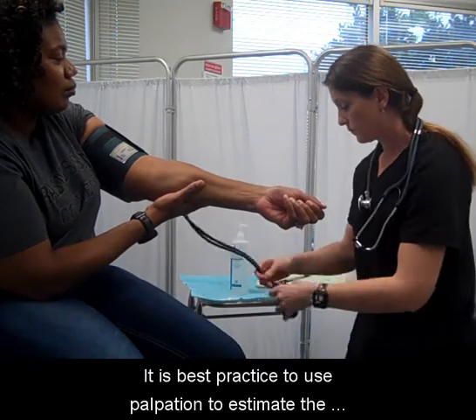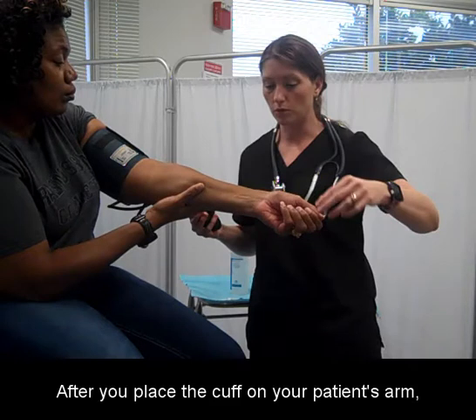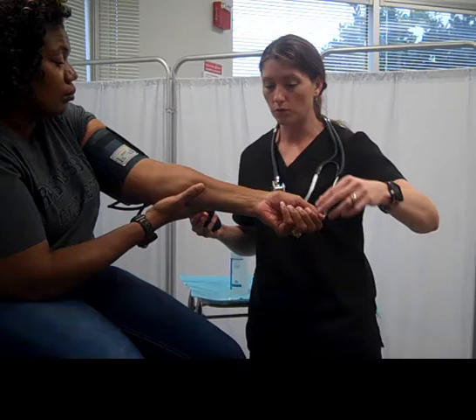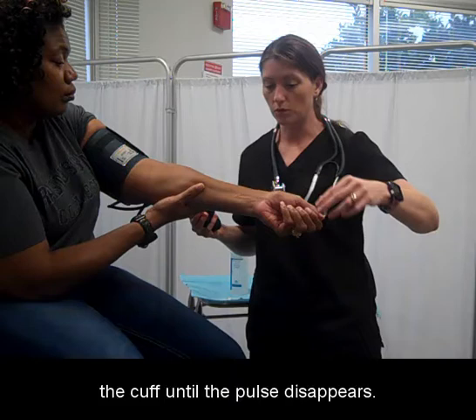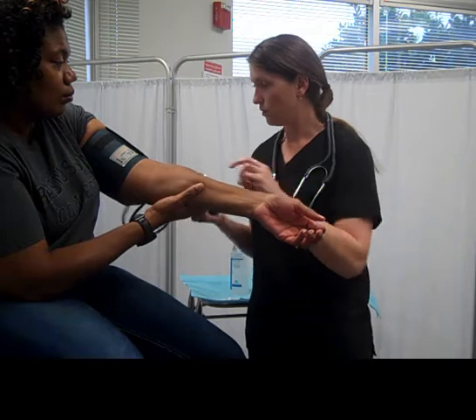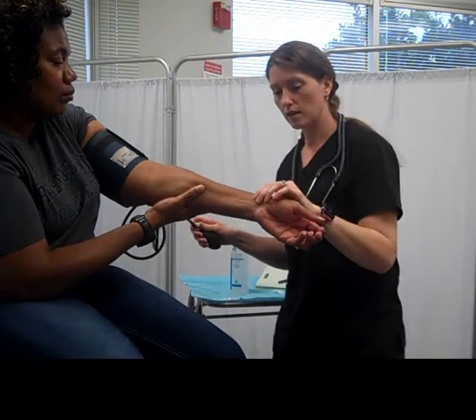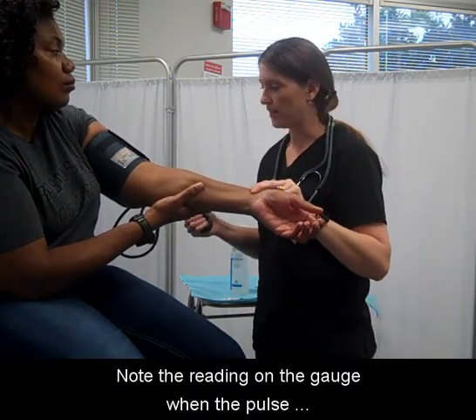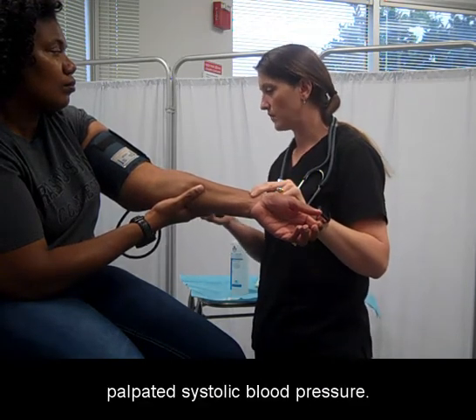It is best practice to use palpation to estimate the systolic blood pressure. After you place the cuff on your patient's arm, you will locate the radial artery. Once you locate the radial artery, you will feel the pulse. You will then slowly inflate the cuff until the pulse disappears. Note the reading on the gauge when the pulse disappears, as this is going to be your palpated systolic blood pressure.